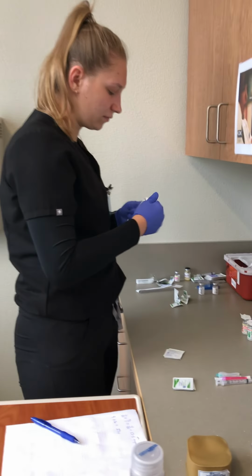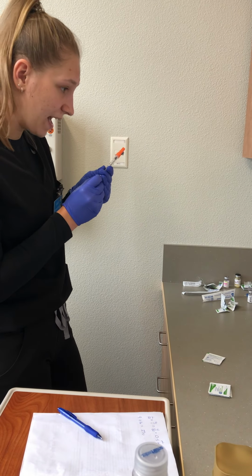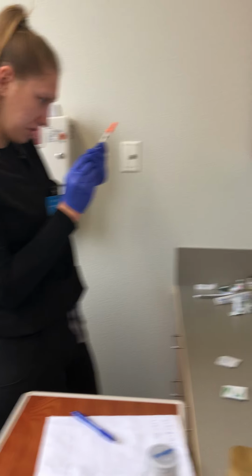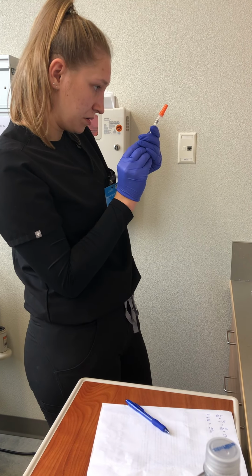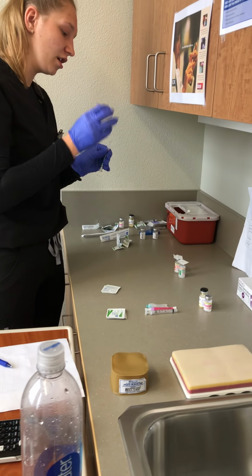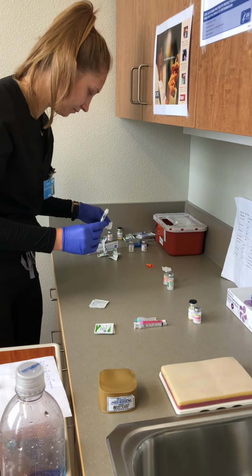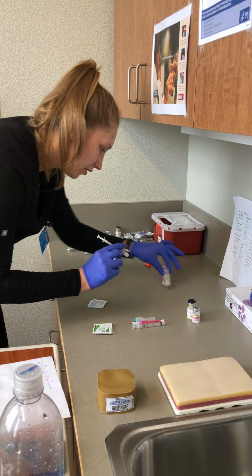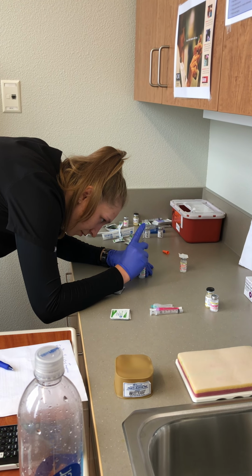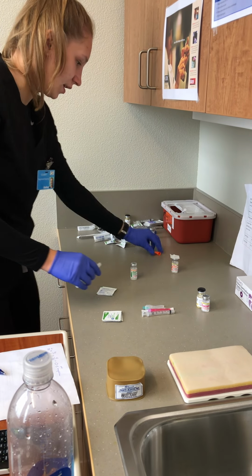Okay. So for this one, I'm going to start with my NPH, and I'm going to draw back 16 units of air. It's kind of hard to see. There, and I'm going to inject this into the NPH without touching the solution inside of it. We're going to go here. Put in the air. Okay.